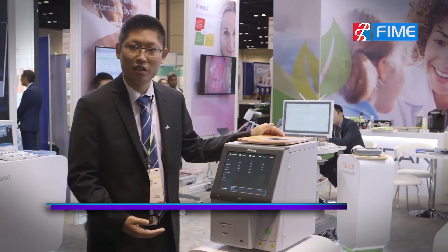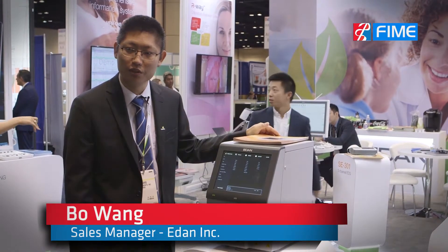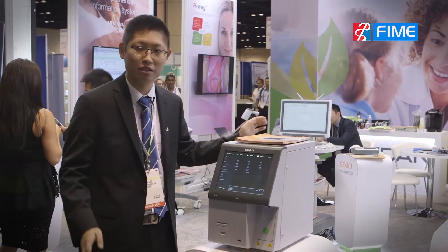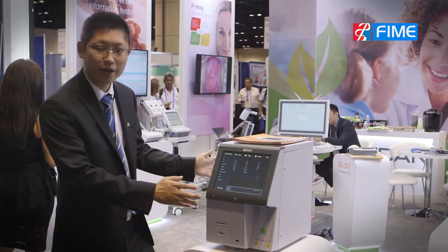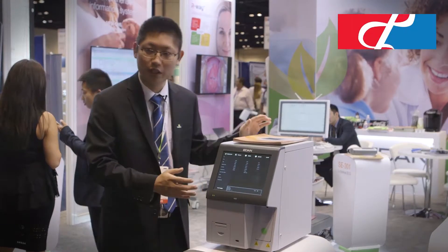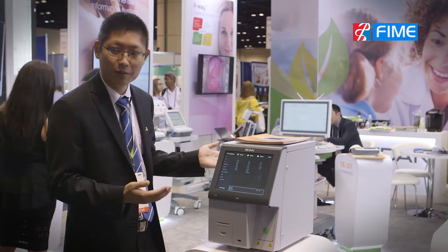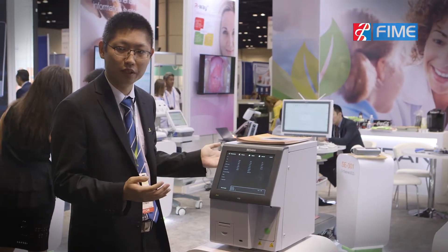This is our new superstar we just launched this year in April 2017. We brought this analyzer here to show to our customers. You can see it's very compact and small. This is for testing the blood test — the CBC. It's a three-part hematology analyzer for testing 20 parameters.